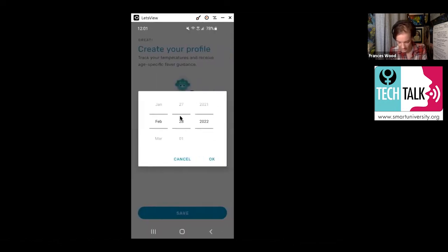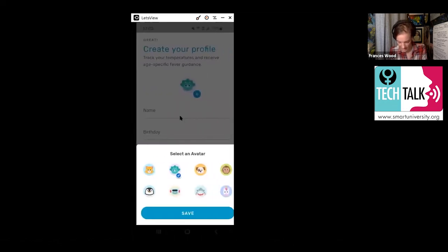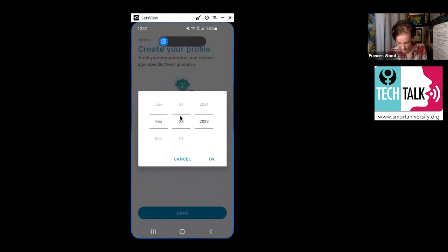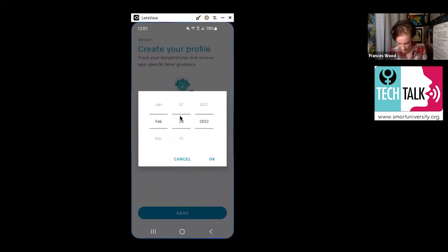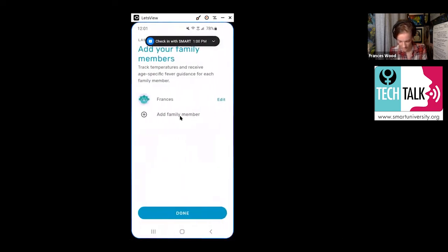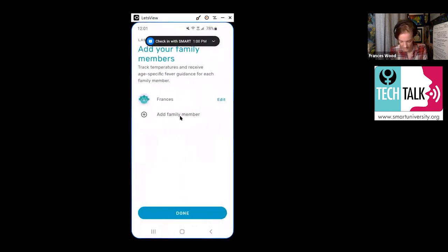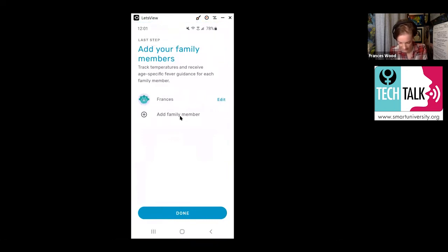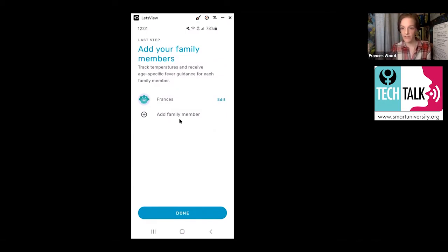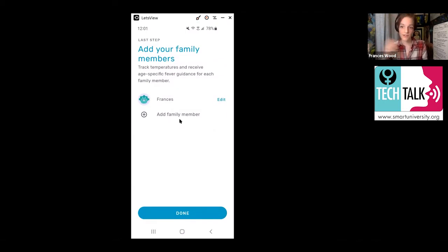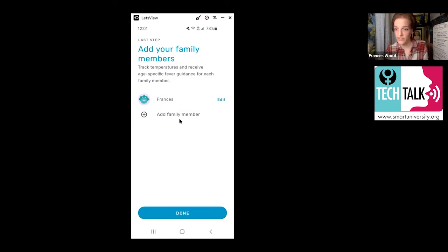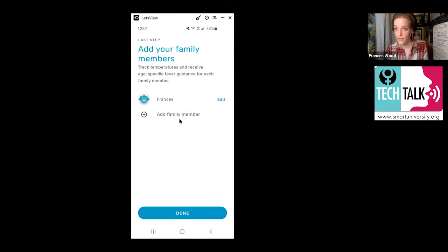And then on there it's going to say gender. I believe it says male, female or something else. So just enter that how you identify. And then it's going to ask you if you want to add family members. You can do that whenever. You don't have to do that right now. If there's multiple people in your household that you want to use this thermometer, then you can add family members along the way. The process is just like what we just did for you.